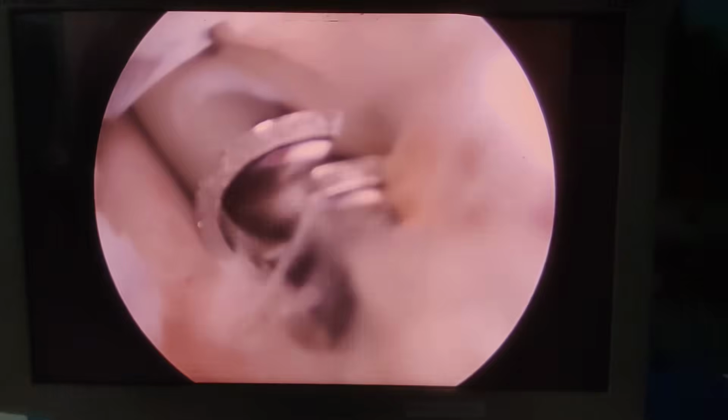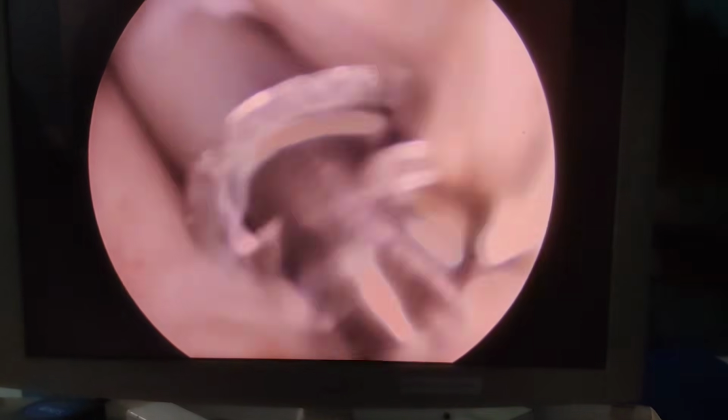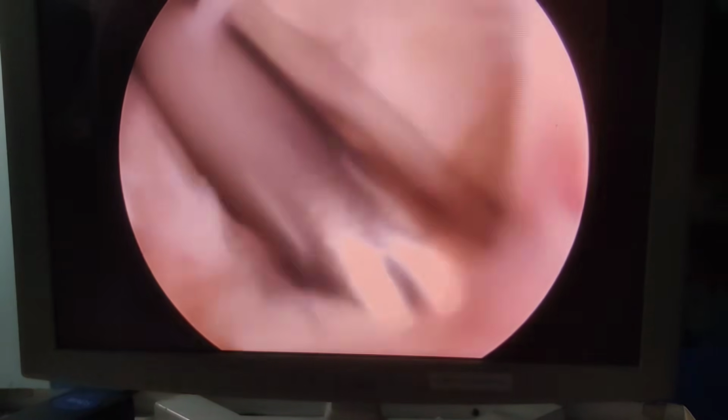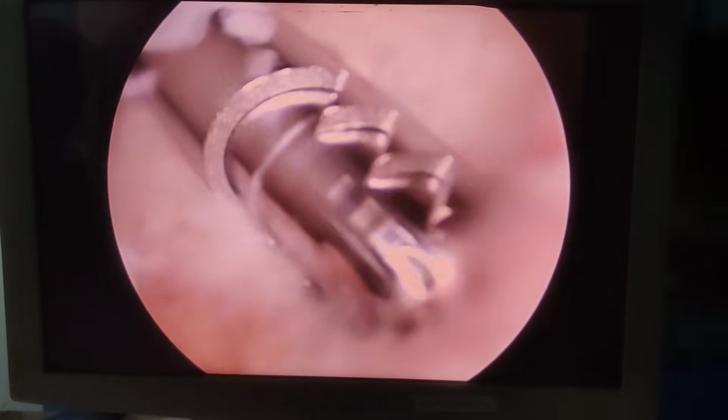So now I have my shaver in the posterior medial portal, and I am keeping the shaver towards the tibia, and then I am just going to start debriding the stump, the PCL stump on the back of the knee. And this is the tedious process, because it can take a lot of time. So the key is to keep the shaver blade either down or up, but never on the back, because the vessels are on the back and you don't want to be going anywhere close to that. So let me just work a little bit and then I will join you back.